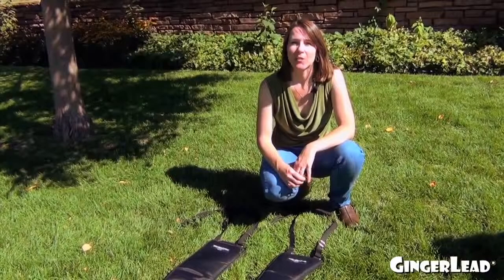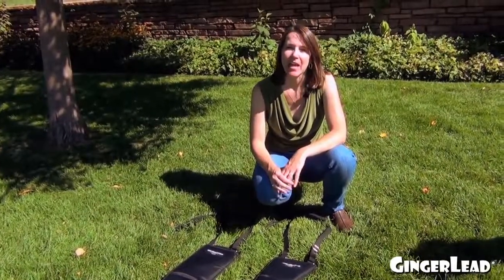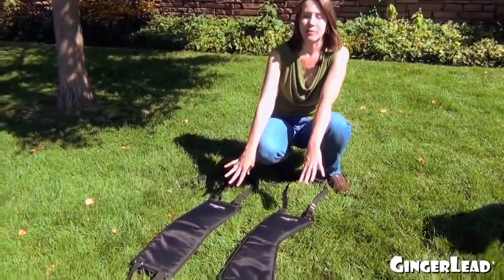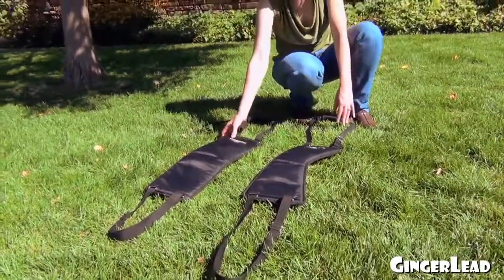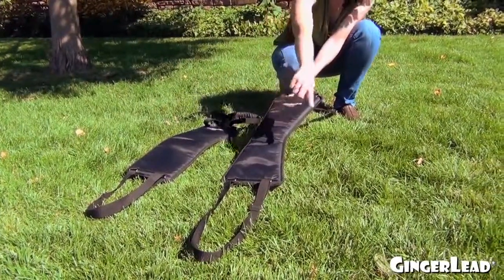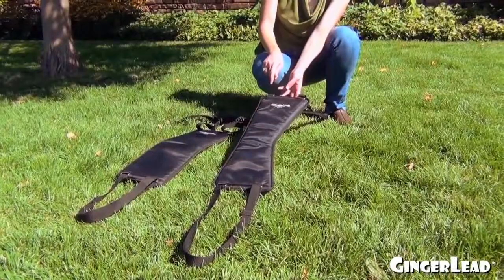Hi, I'm Liz with Gingerlead Dog Support and Rehabilitation Harnesses, and I'm going to give you some tips on how to use a Gingerlead. In front of me I have a large male and a large female Gingerlead. The female Gingerlead is rectangular in the pad, and the male Gingerlead has a cutout in the support pad for the boy parts.